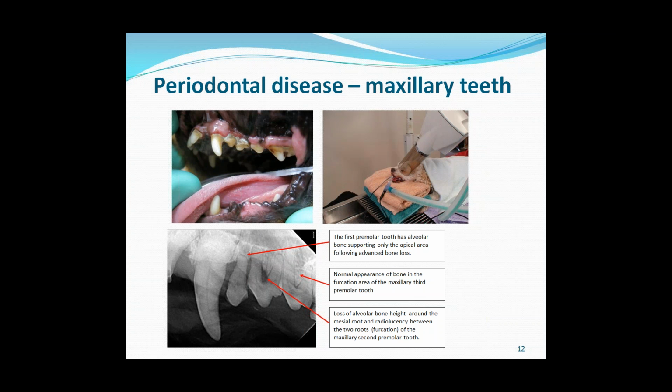But the tube head is placed, if the dog's head is placed axially and the dog is in sternal recumbency and symmetrical, then the tube head is placed at around 45 degrees to both the horizontal and the vertical to get a normal radiograph without elongation and shortening.